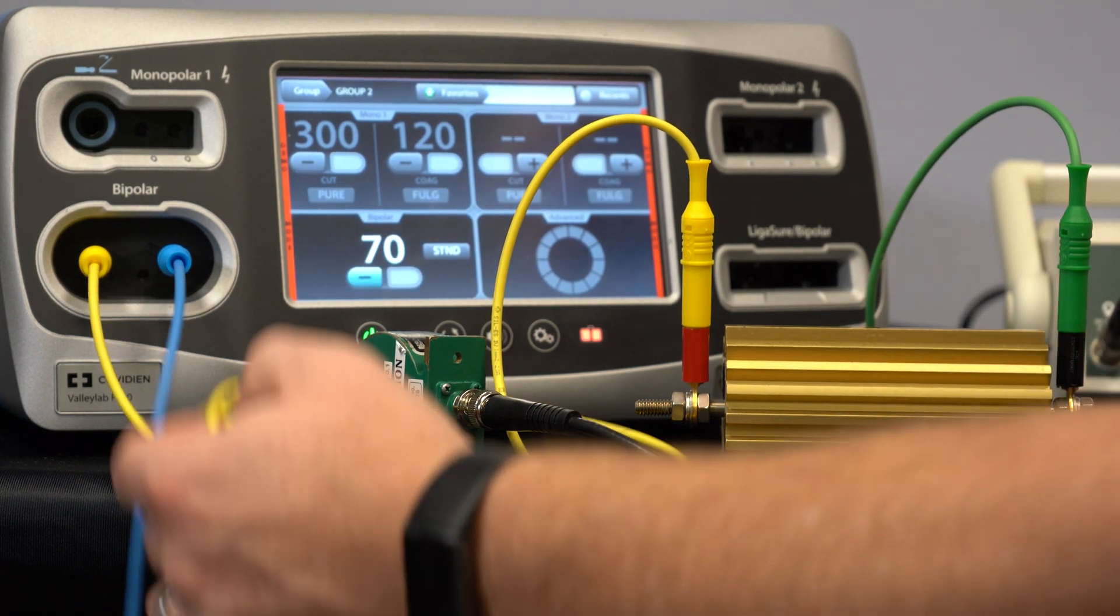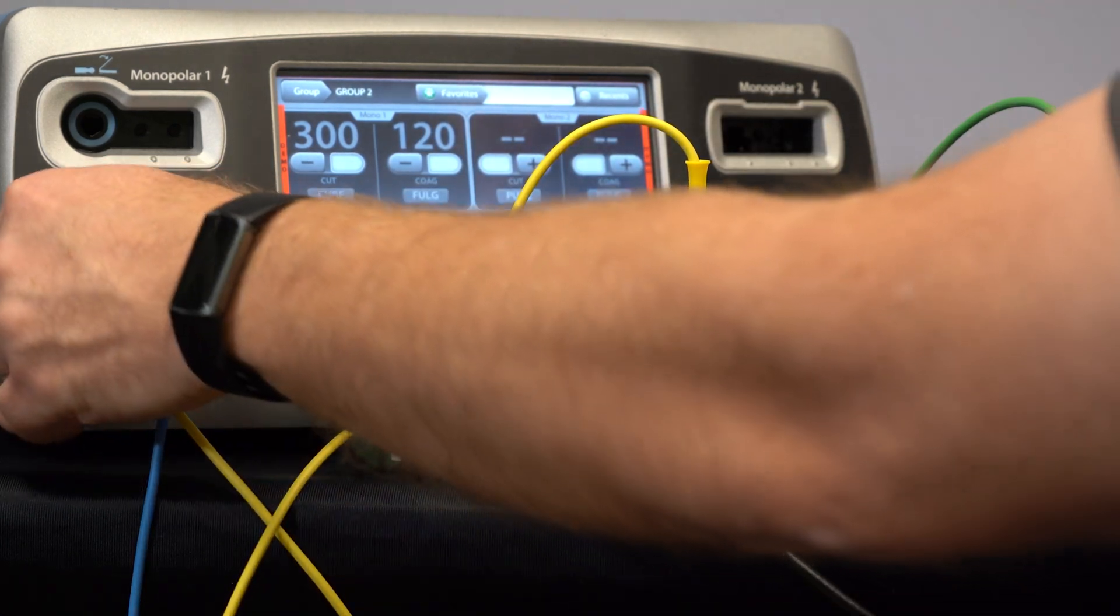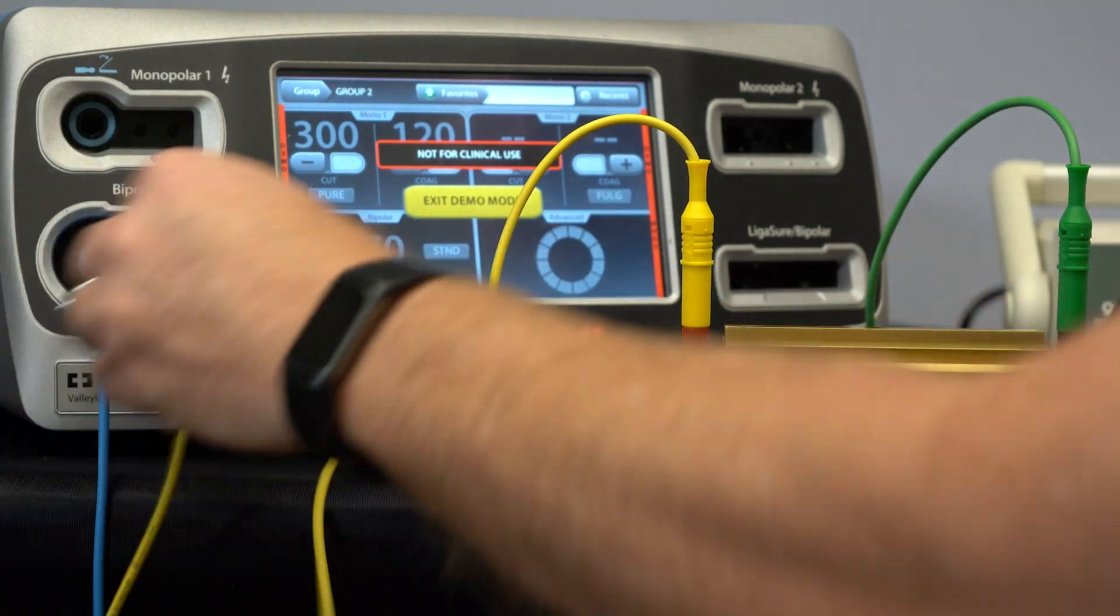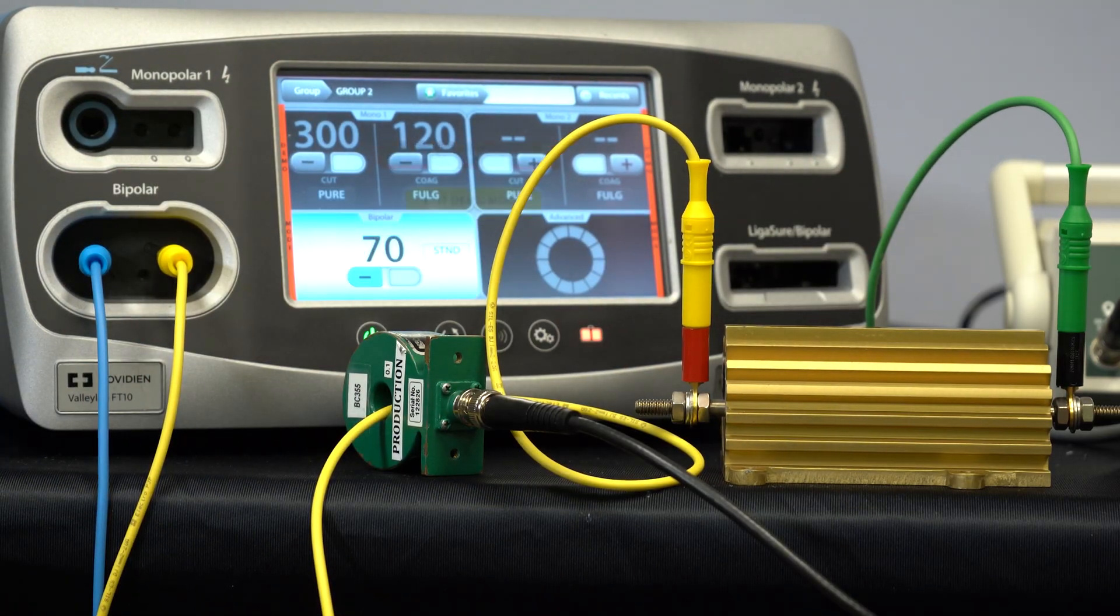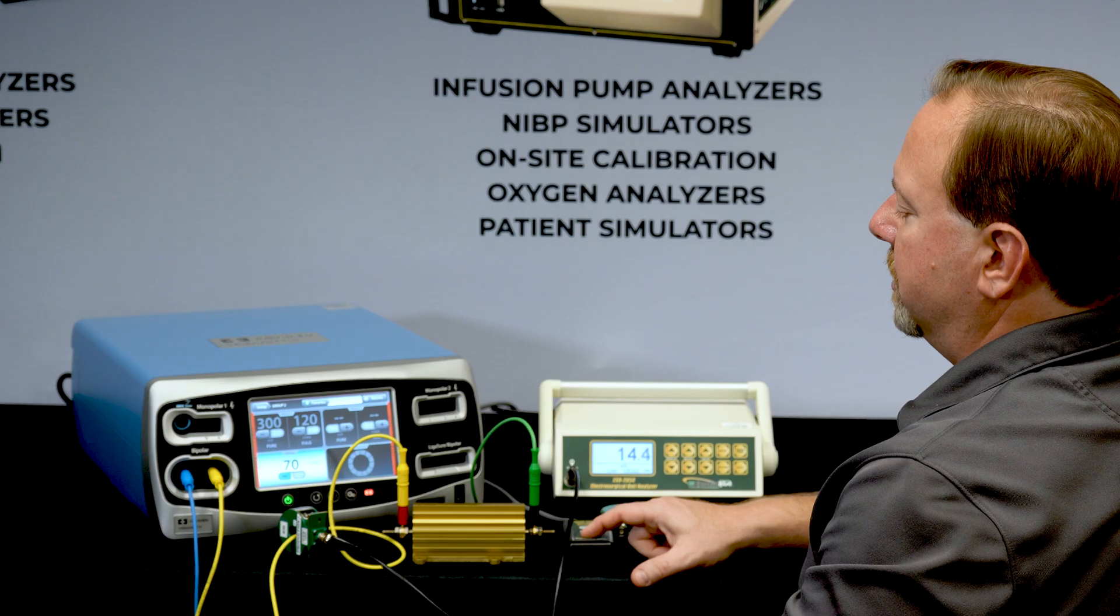And we're measuring from the active port through the load to earth ground. Now for bipolar they ask you to test both ports independently. So we would also go and test the other port and make sure that has a safe leakage to it.